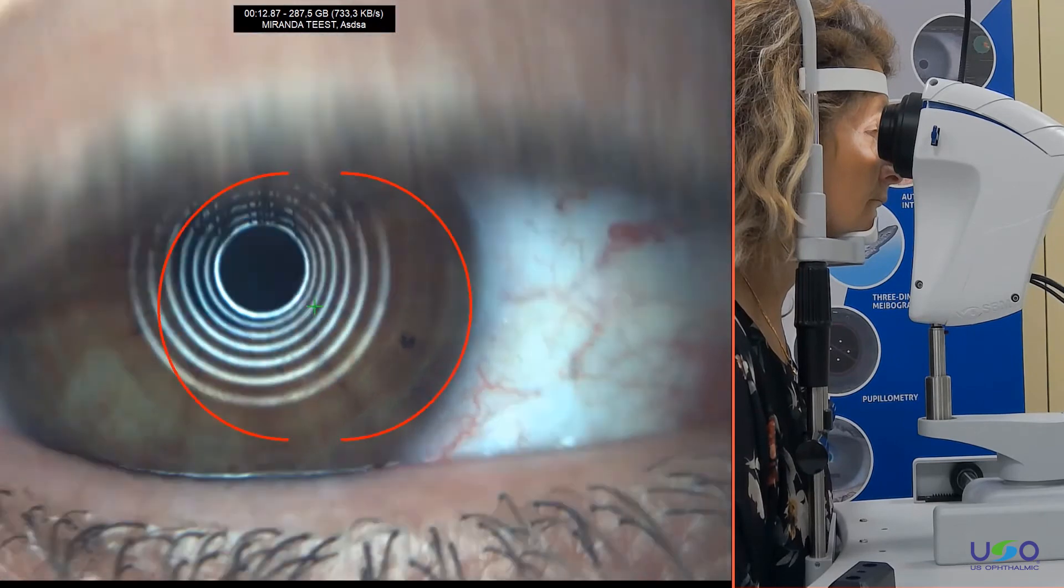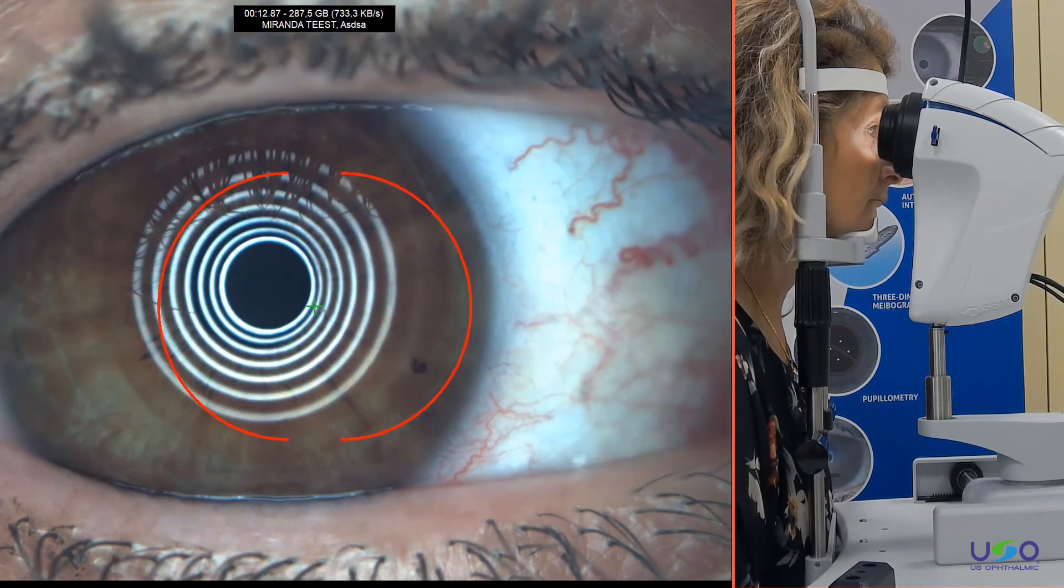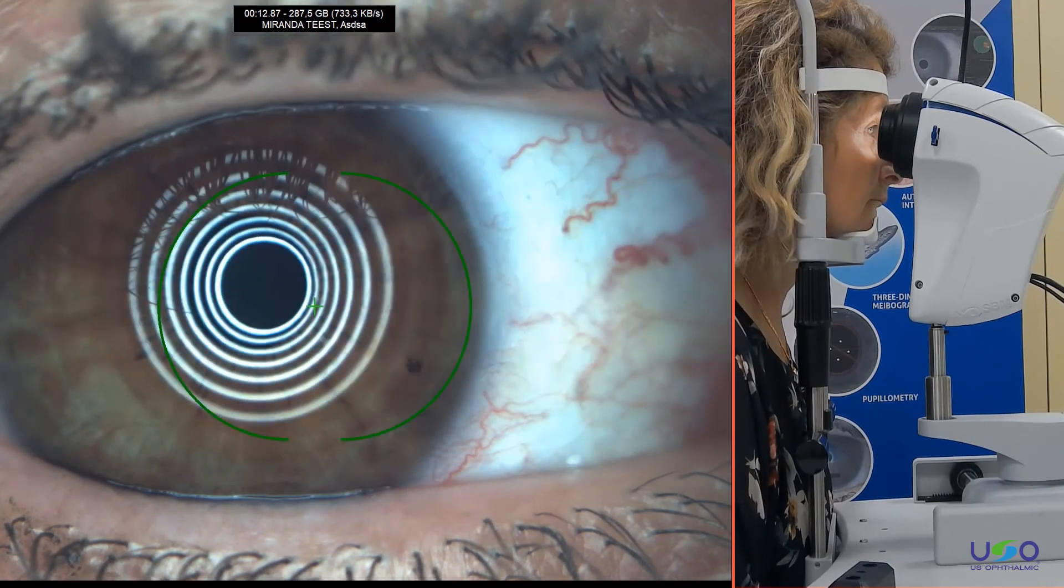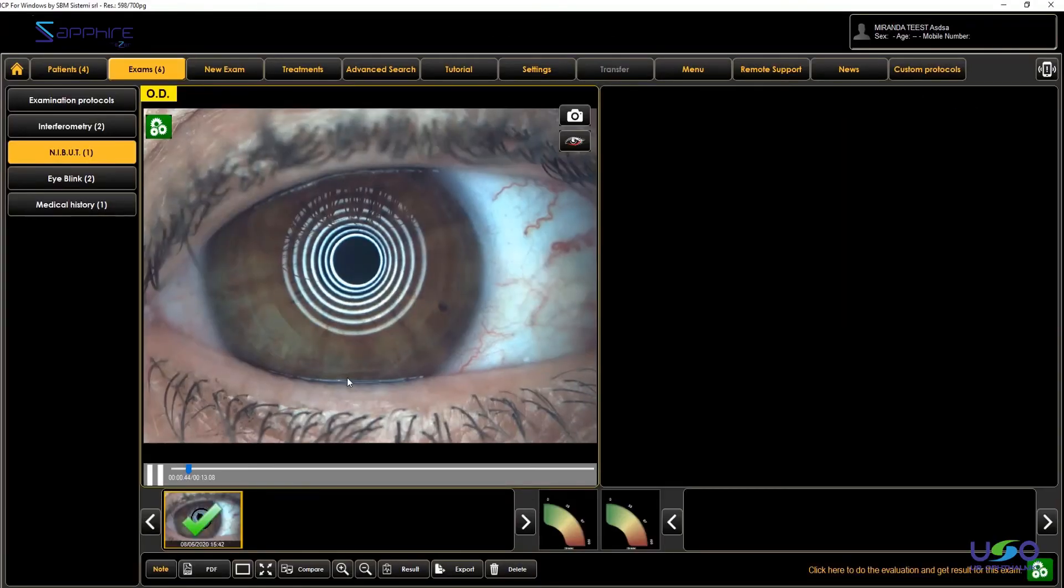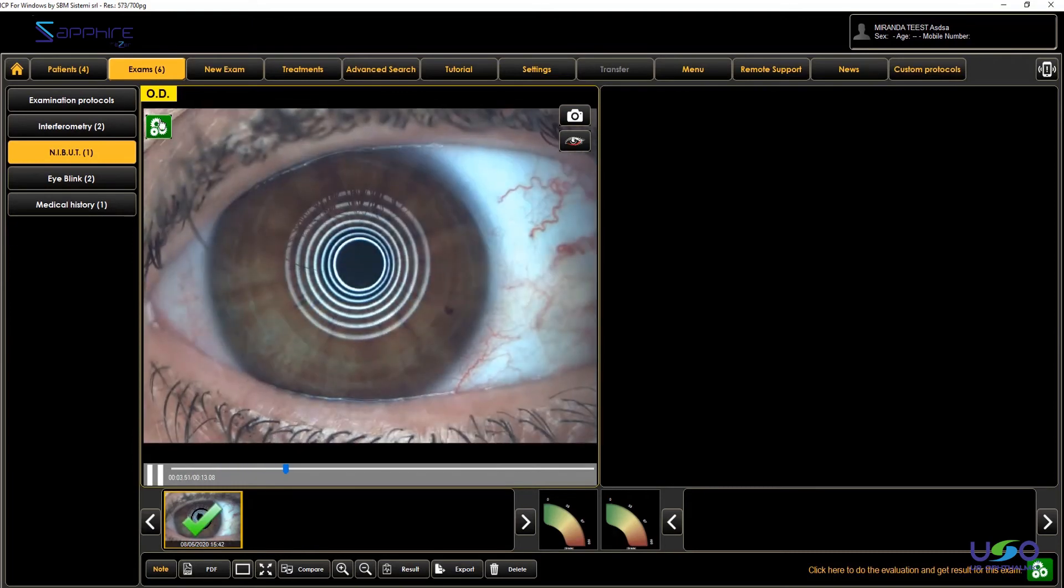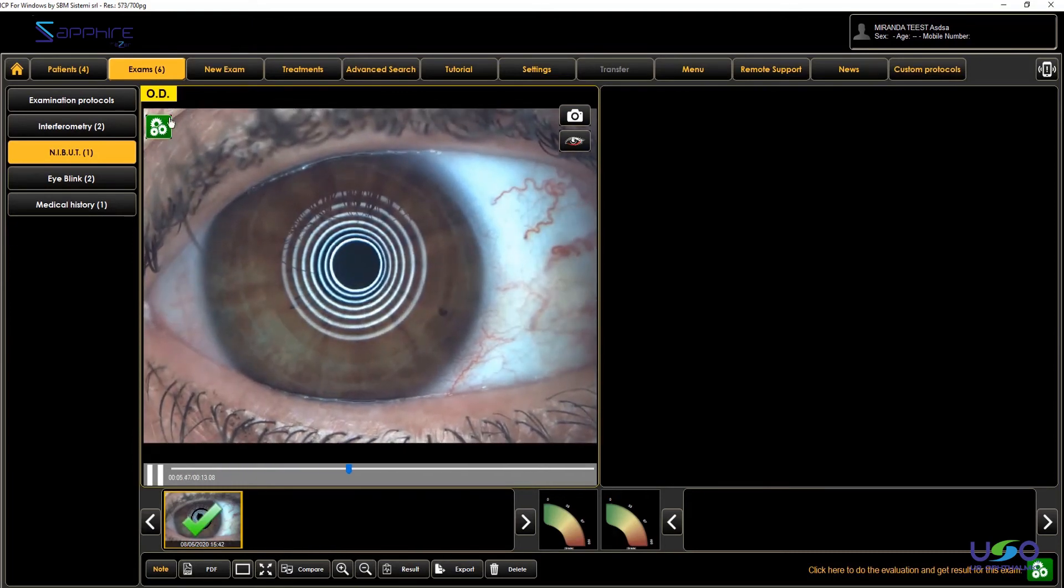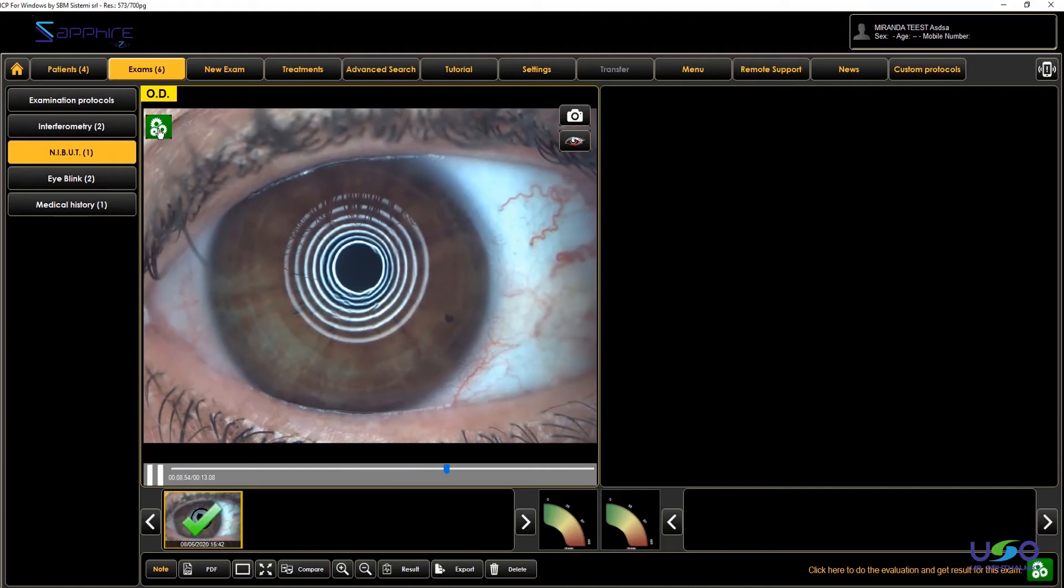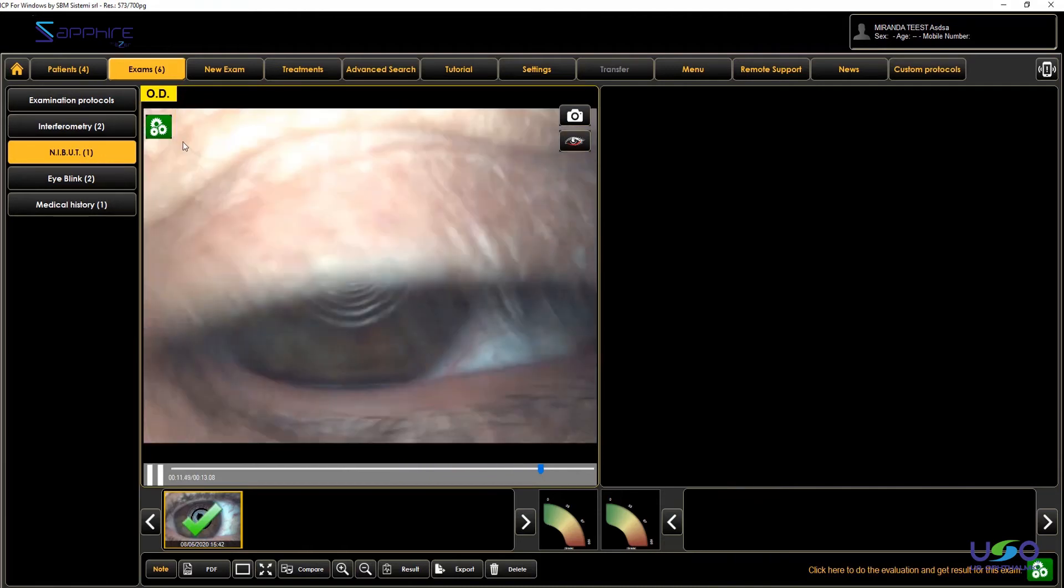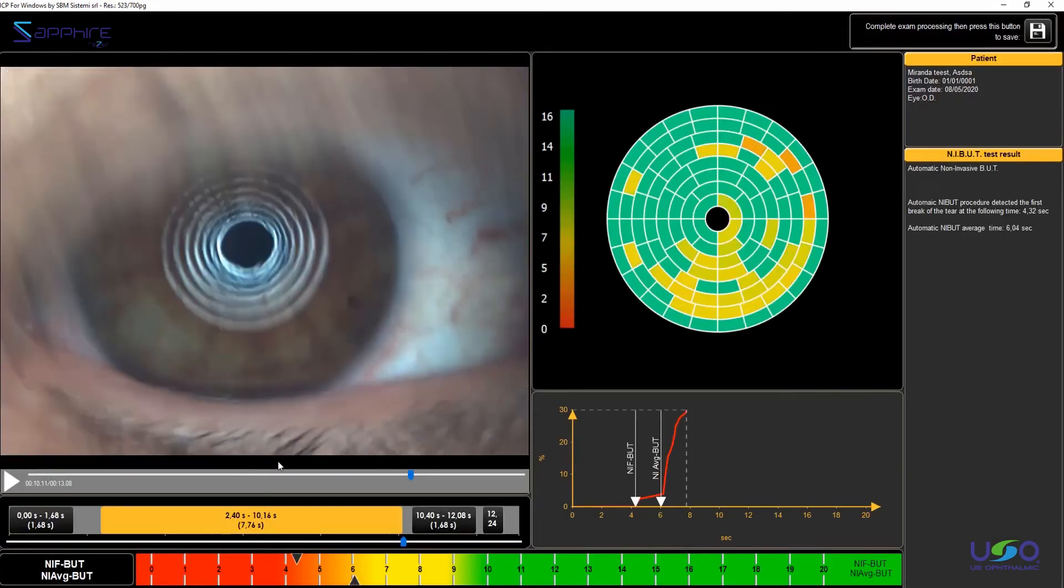So if you want to take another examination on the other eye, you can just select the new eye on the select eye button. After acquisition, we just close the video. And we have the green button on the top left corner, which as for interferometry and I blink, means do the analysis. So I push on it and we are going to see the analysis.